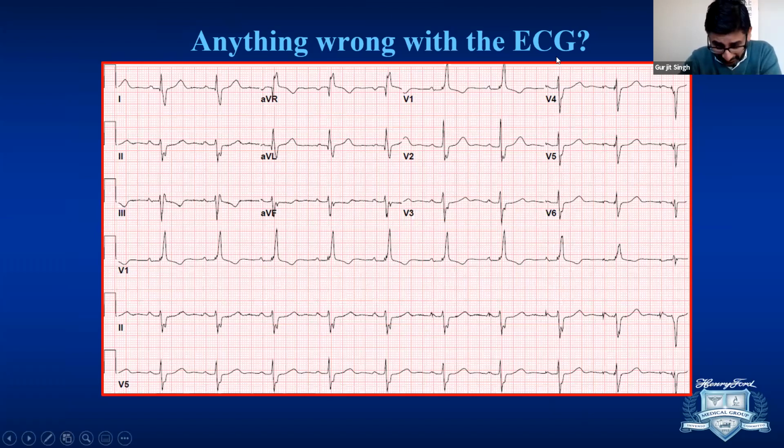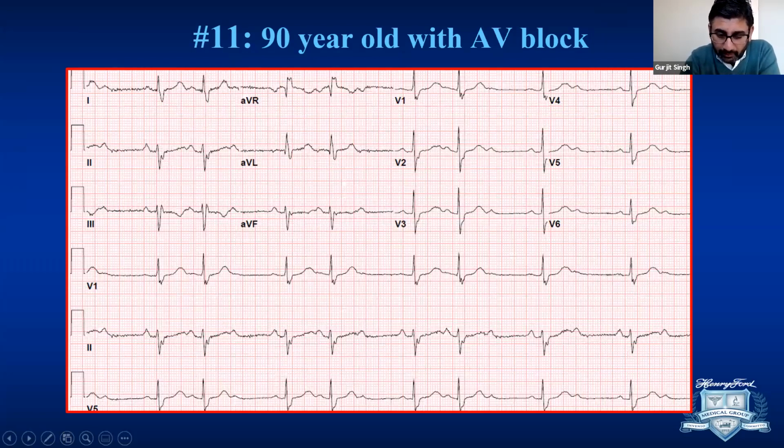Any responses, Ralph? Because this is a good ECG, which covers a lot of things at the same time. Yeah, not yet. Give it a minute or so. So I'm a little confused. There were two ECGs. So the first one you showed. What I'm showing you, yeah, the first one is the patient's pre-implant ECG, just showing that he does have some kind of AV block, and that's the QRS morphology. And this is now with the pacemaker in. Okay. Yeah, we could see the one with the pacer in.